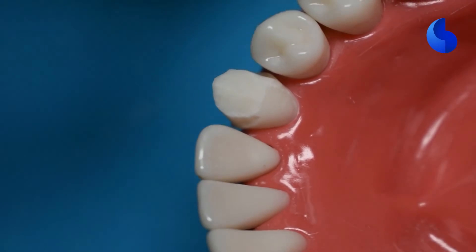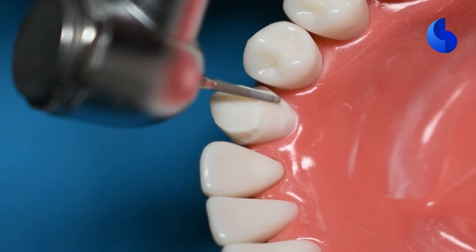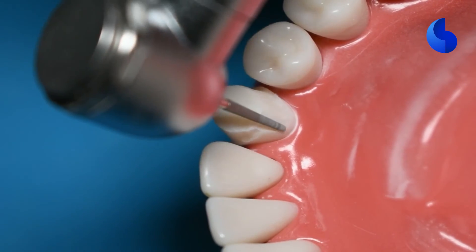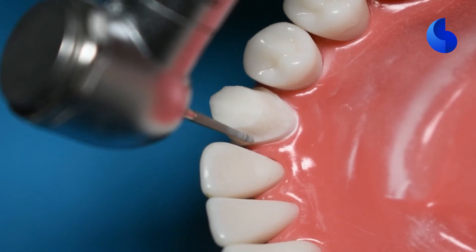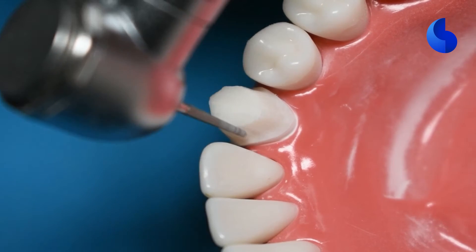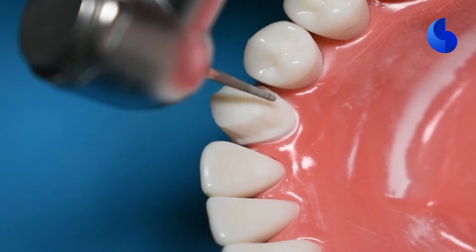Once you've prepared the interproximal, go on to your lingual reduction and then come back to revisit the proximal surface for further refinement. On the lingual surface, remember that the canine has a ridge that runs through it. You have to preserve that, and the best way is to reduce one side of your lingual surface first and then move on to the other side. Always place your bur parallel to the long axis of the tooth so that you're not creating too much taper, and keep your margin 0.5 millimeters supragingivally. As you can see, the initial reduction we gave on the lingual is helping now because it's oriented perpendicular to the opposing tooth. Continue to reduce using the 856-016 bur and take it interproximally to refine the initial preparation while establishing a 1 millimeter width finish line.